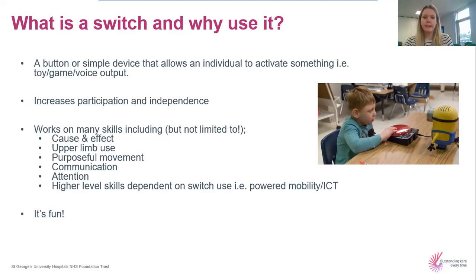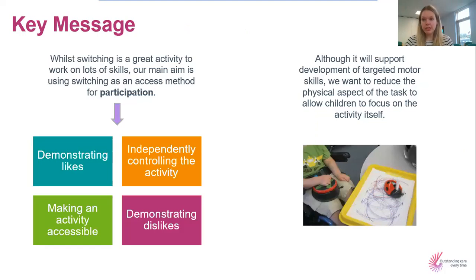So one of the key messages that we wanted to get across is that although switching is a great activity to work on all those skills, we're really looking at it as an access method for participation. So what that means is we want to reduce the physical aspect of the task to allow children to focus on the activity itself. So we don't want them to be working so hard to use their hands or head that they can't then enjoy the activity that they're participating in.